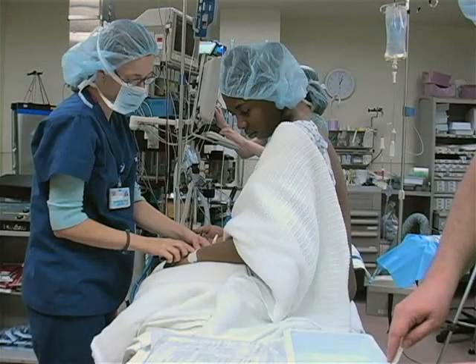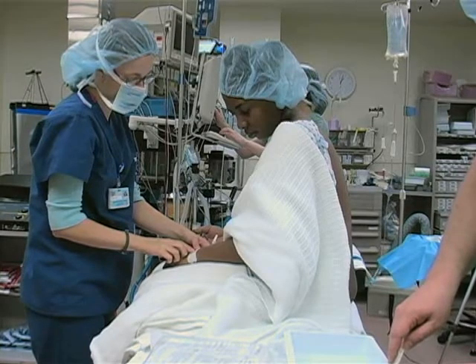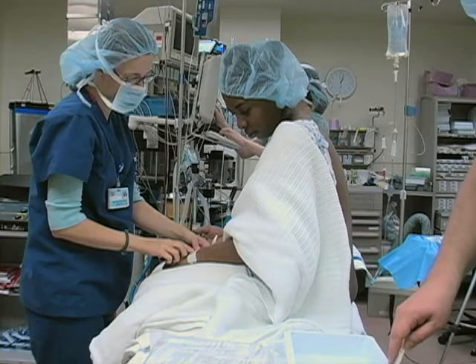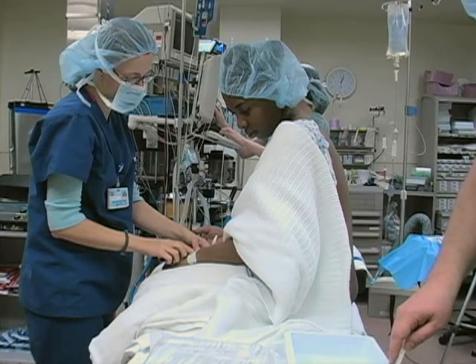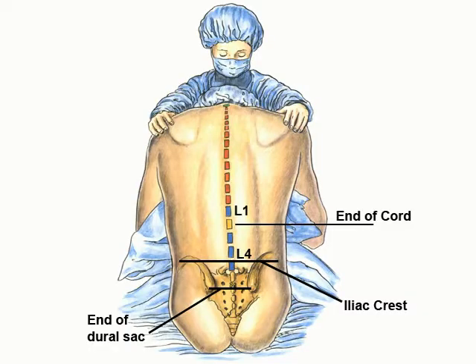Position the patient in the upright sitting position with his or her back facing you. Ask the patient to place his or her chin on the chest, allow the shoulders to droop, and arch the back toward you. Palpate the patient's spine to identify the vertebral interspaces, starting at the level of the iliac crest. This approximates the L4 level of the spine.